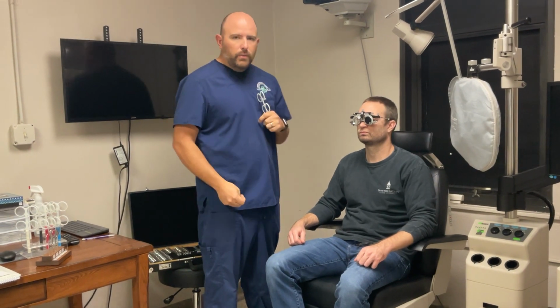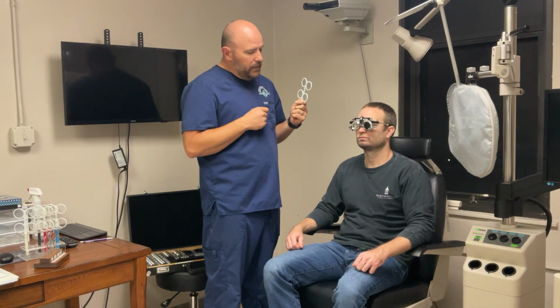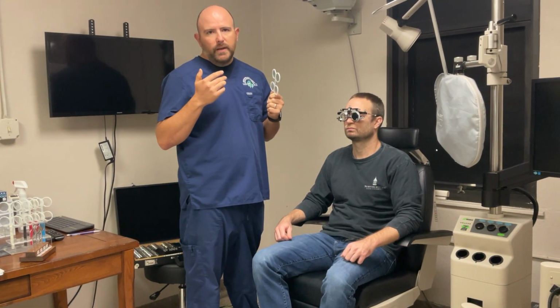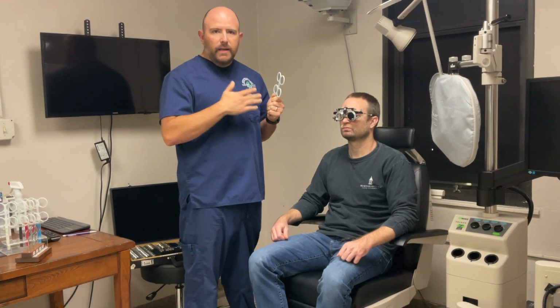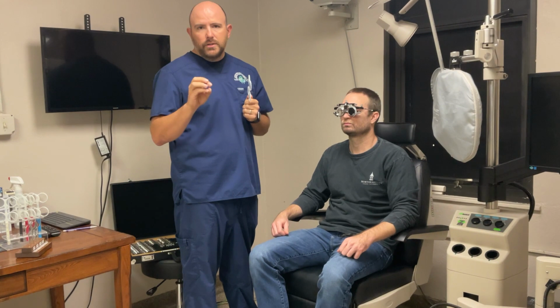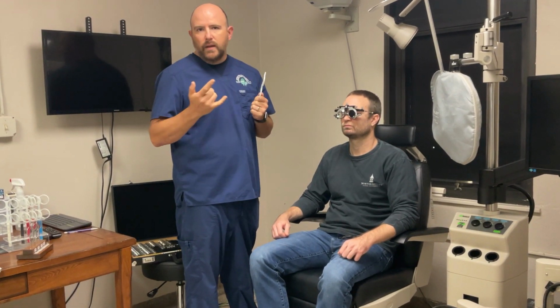But what I do with the patient oftentimes is I just want to check and see around the 4.50. So technically we're checking to see if the patient wants a minus 4 versus a minus 5. But what may often happen is if you're right on the money as far as your refraction is concerned, is that the patient will note that neither lens is better than the other.